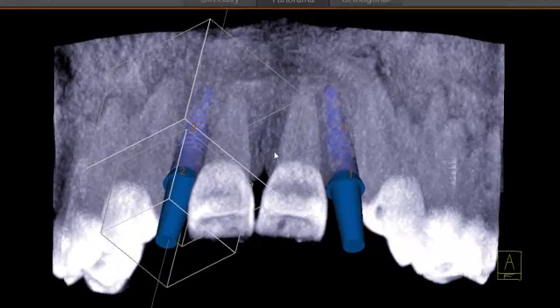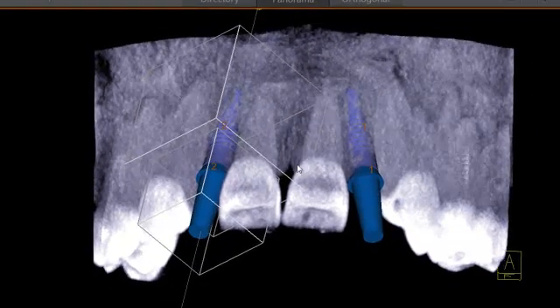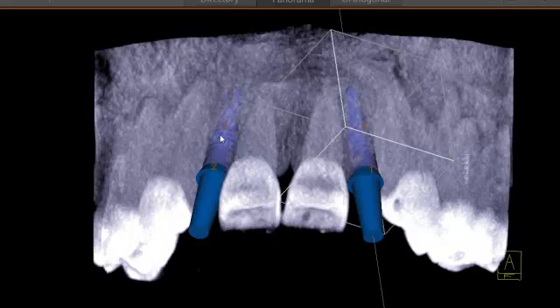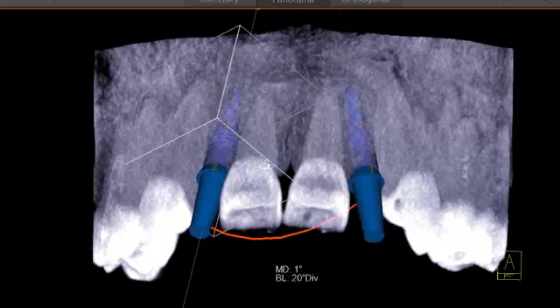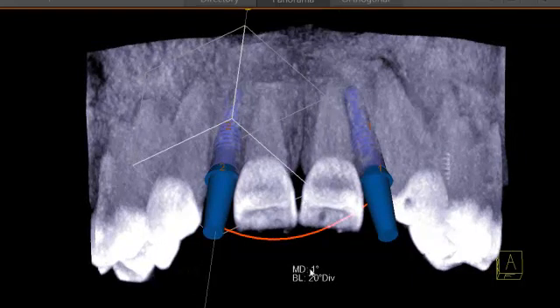We can check it over here in our 3D view. If you ever needed some quick measurements, you can click your first implant, click the little angle tool here, then click your second implant. You can see I get a real quick mesiodistal 1 degree, buccal lingual 20 degree diverging.